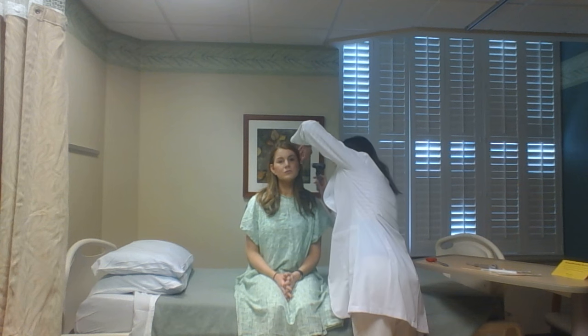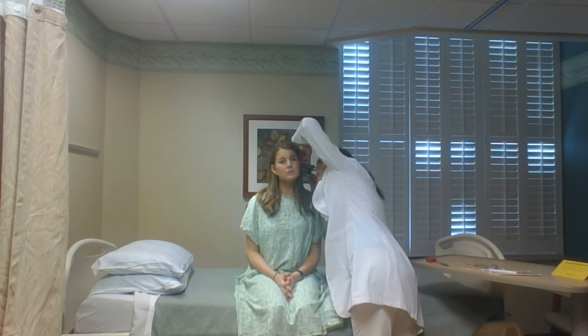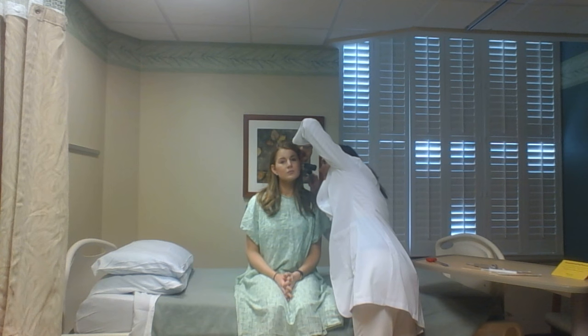Okay. And then with my otoscope, I'm going to look in her ear. I'm going to make sure I pull her ear up and back. I'm looking inside. I'm looking at the tympanic membrane. It appears pearly and gray, and the light reflex is present.